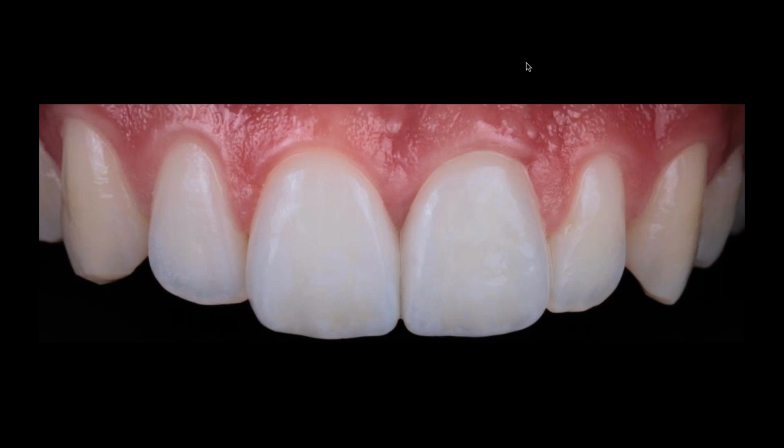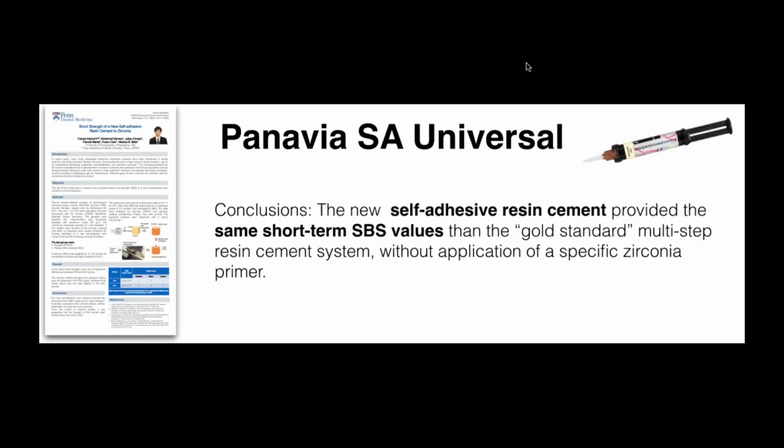This is not made by me, this is made by Michael Bergler with the same material, but what I want to show here is, as clinicians, to be honest and to understand our limitations. Maybe this was not such a straightforward case for me, and sharing with Michael, a master ceramist, but giving my input on the materials and what I like from feldspathic ceramics was something that at the end was a very nice result for the patient.